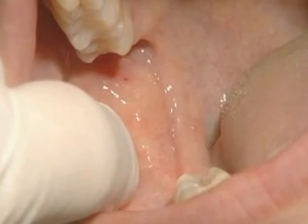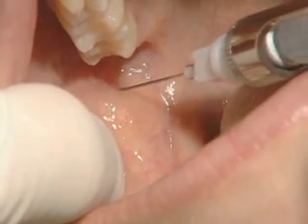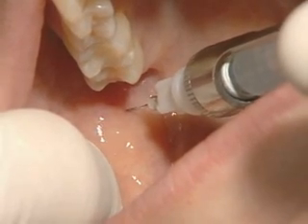Palpating the intraoral landmarks, and just open really wide. The syringe is going to approach from the opposite side, going below the mesiopalatal cusp of the second molar. The needle is advanced 25 millimeters till you hit bone. Back off slightly, aspirate, and then slowly inject.